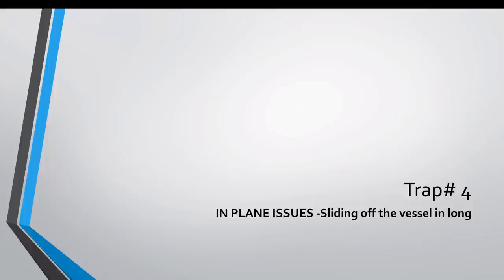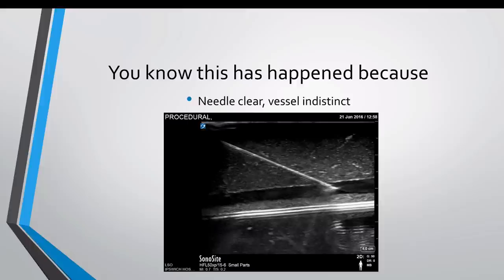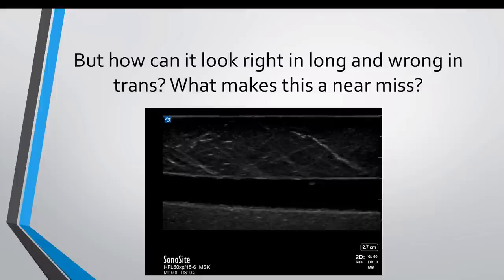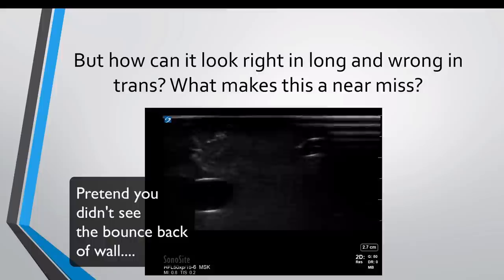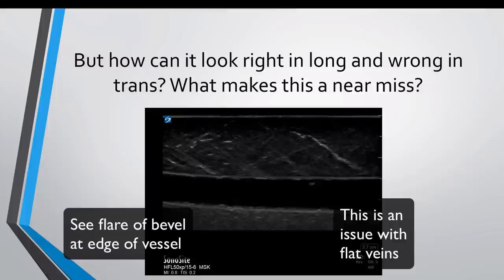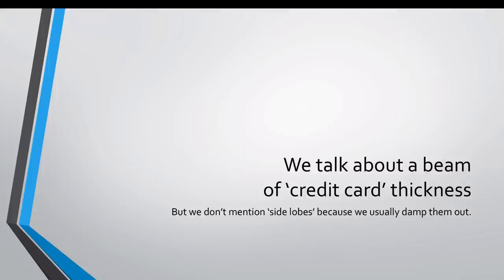Trap number four is when you think you're in the vessel — it looks like you're in the vessel but you're not getting any flashback. A common scenario is when you're trying to cannulate a fairly small and fiddly radial artery. This problem almost always happens in longitudinal. Although the needle looks like it's smack bang in that vessel, in actual fact it's not. Here's an example: it looks like we're in the vessel in long, perhaps not quite in the middle, but when we turn 90 degrees on the vessel you can see I've just skimmed down the outside.